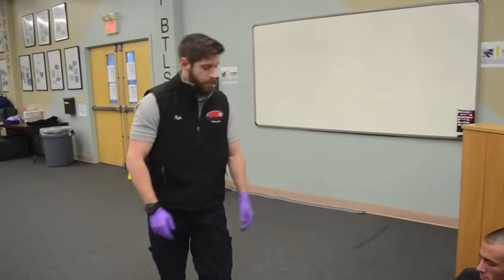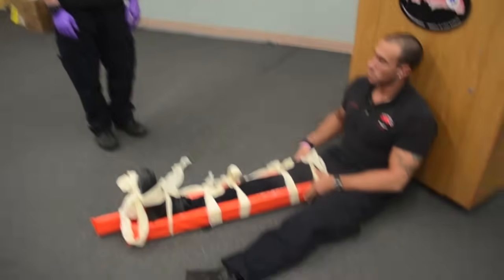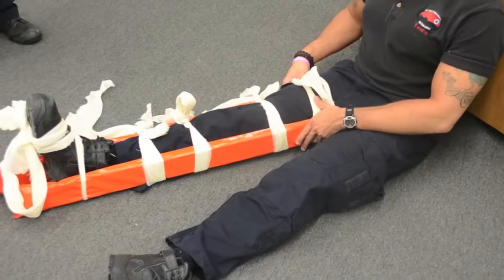Is there anything else you would like to do for this patient? None. I have completed this station. Thank you.